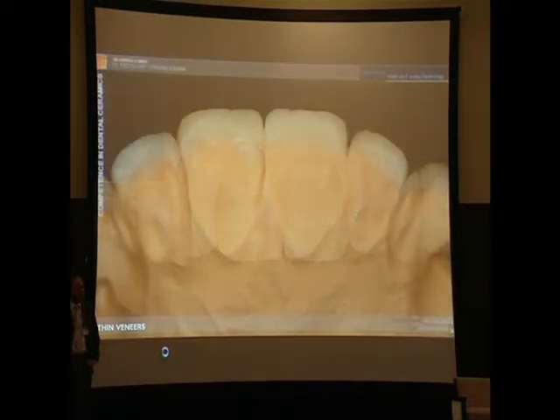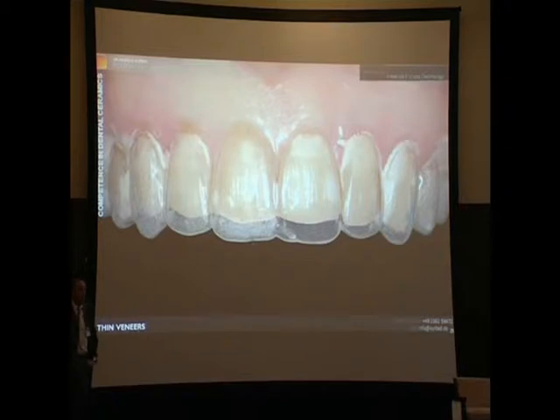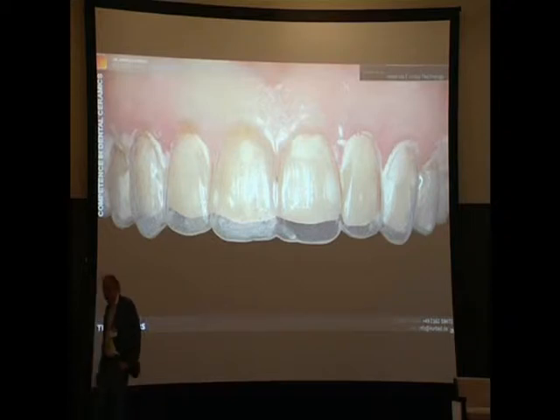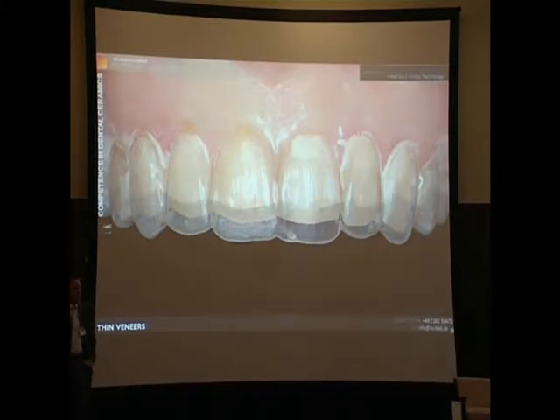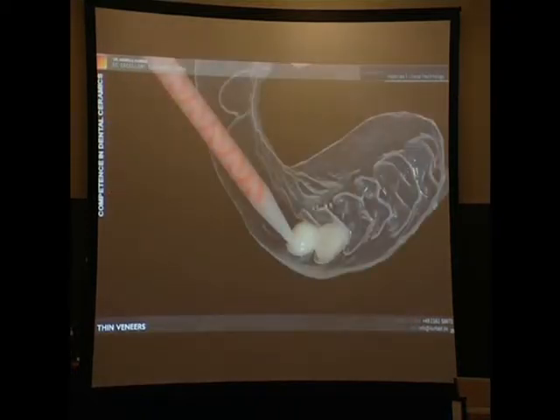Look, we made the incisor edges much longer than before. If you do this, you should urgently have the confirmation of the patient. Otherwise you can have a lot of trouble. So that's why we make a so-called mock-up, with slight isolation of the underground, and in this case we used the thermoform splint.